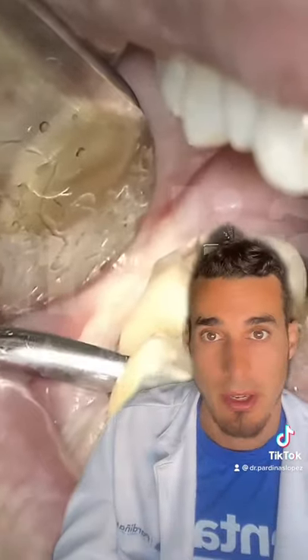First of all we need to numb the area, either with local anesthesia around the tooth to be extracted, or doing a mandibular block, which will numb half of your mandible.